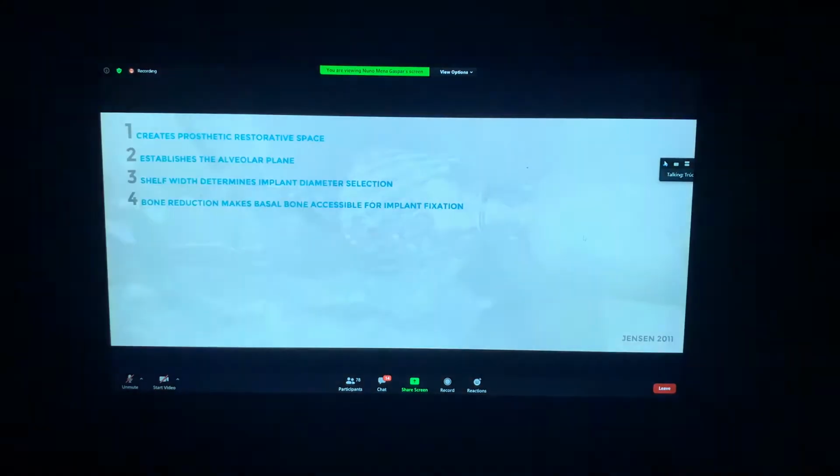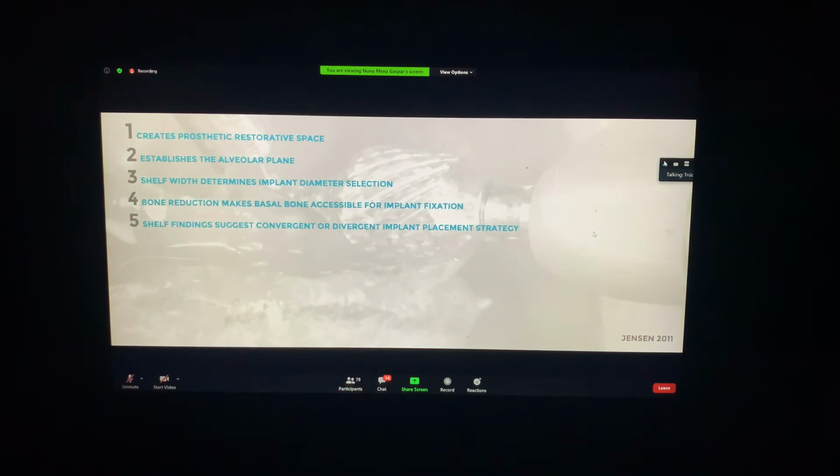Mài thấp xương xuống thì sẽ thấy rõ hơn được nền xương nữa. Okay. After bone reduction, you can define your placement strategy and know where are the first and second implant sites. Và sau khi mài xương thì chúng ta sẽ xác định được là những cái implant được đặt ra như thế nào, những cái hai implant đầu sẽ được đặt như thế nào, thấy rõ được vị trí để đặt implant.